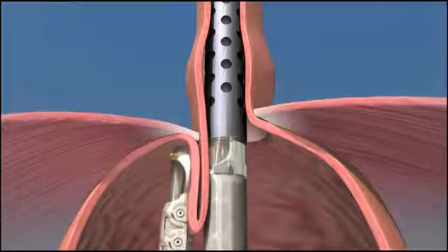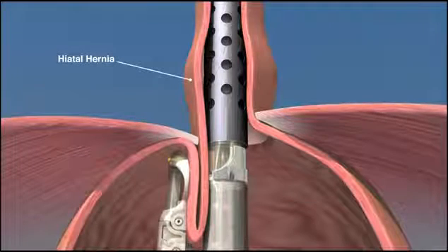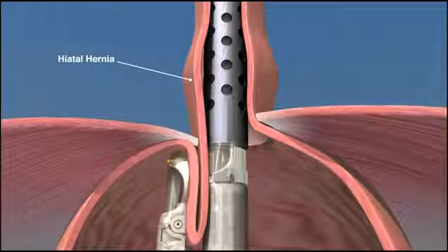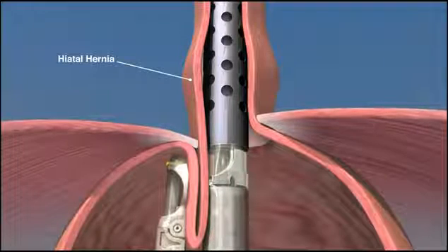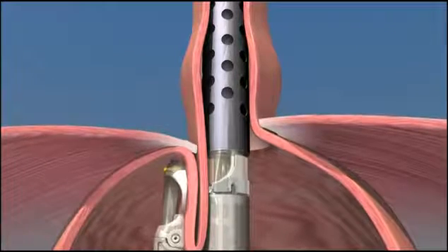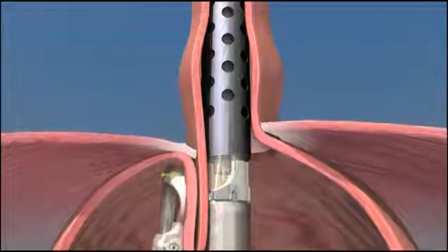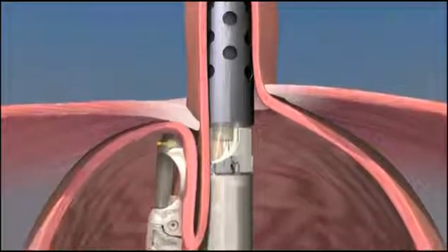Some patients may have a small hiatal hernia, a condition where a portion of the stomach has migrated up through the diaphragm into the chest cavity. If present, the hiatal hernia can be reduced and the esophagus can be lengthened by retracting the endoscope up into the esophagus. Suction is then engaged and the stomach is repositioned down below the diaphragm.